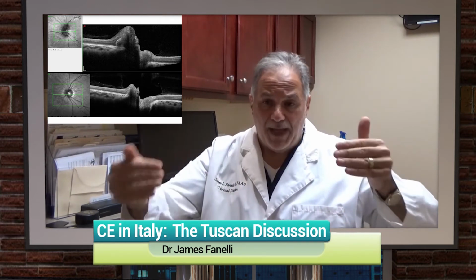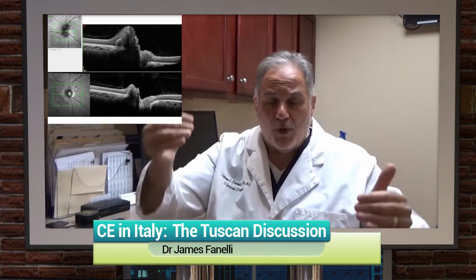We want to take radial scans, cross-section scans through the optic nerve so that we can see the neuroretinal rim 180 degrees apart from each other and see what's happening deep inside and behind that at the level of the RPE and Bruch's membrane.